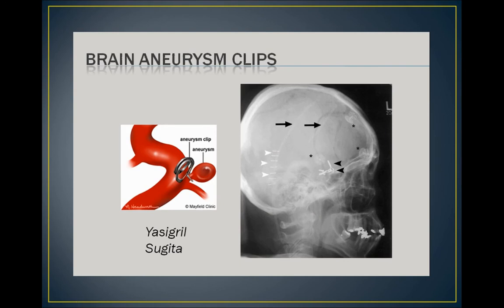Non-ferromagnetic aneurysm clips are allowed to be scanned in the MRI room, but must be cleared and documented. We must document the make and model and also know when it was implanted. Patients should carry an implant card, but we may need to obtain operative notes if the card is not readily available. This process could be lengthy, especially with surgeries dating very far back.